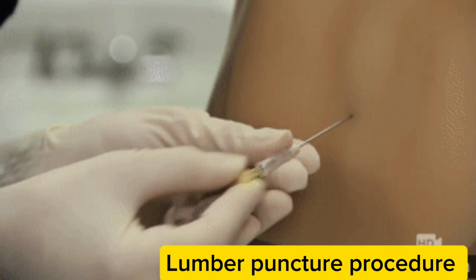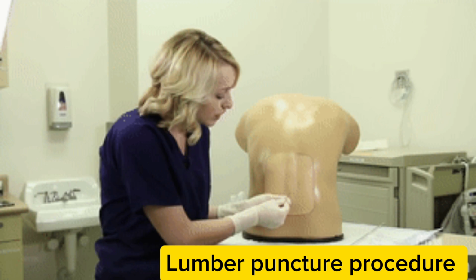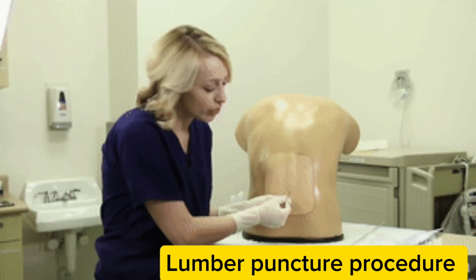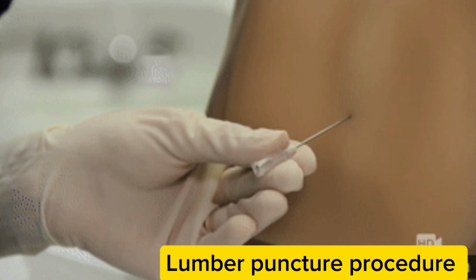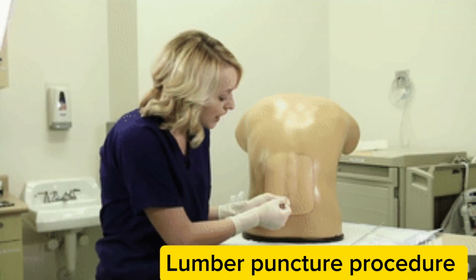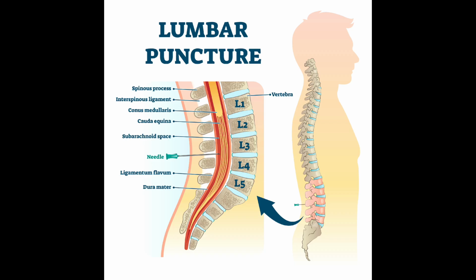A lumbar puncture, also known as spinal tap, is a test used to diagnose certain health conditions. It is performed in the lower back in the lumbar region. During a lumbar puncture, a needle is inserted into a space between two lumbar bones called vertebrae. Then a sample of cerebrospinal fluid is removed.